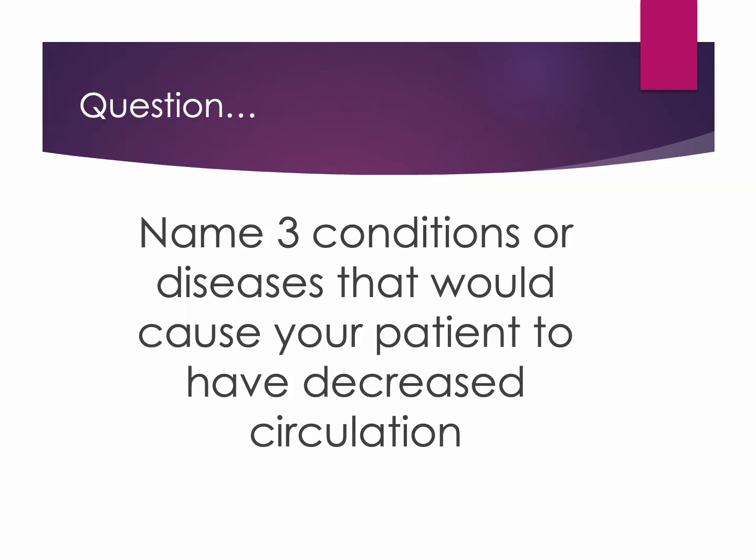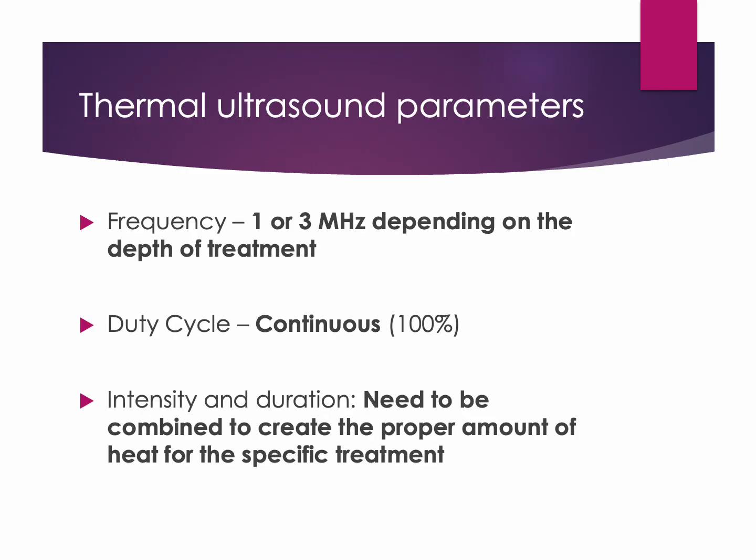Since we know that decreased circulation can easily and quickly burn a patient using thermal ultrasound, what are 3 health conditions or pathologies which could decrease a person's circulation to the area you are treating?